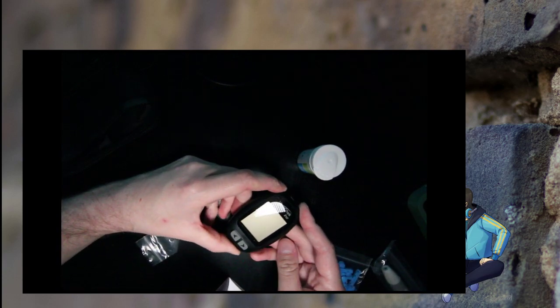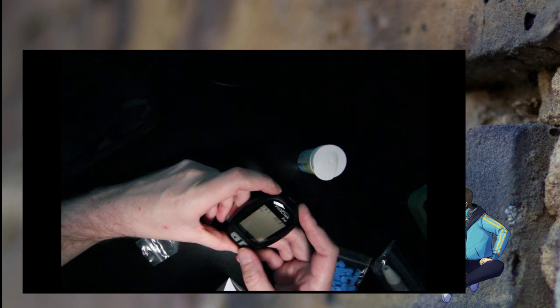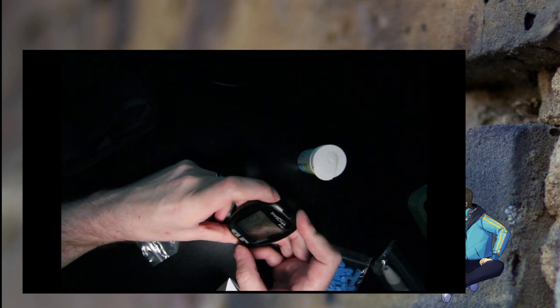Okay, let's have to set the date. Enter a setting mode and set time. When the meter is off, press and hold the thing. Okay, now it starts up. Yeah, it is 1953. That's fine. Hypo warning off. Ketone warning off. Alarm, sure. All off. I want to keep them all off. Okay.